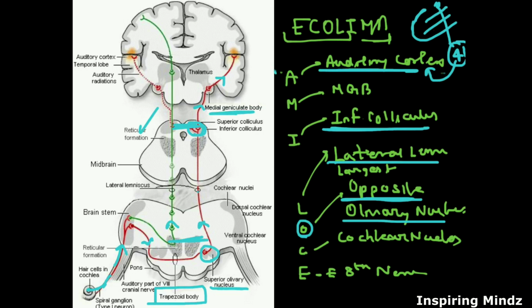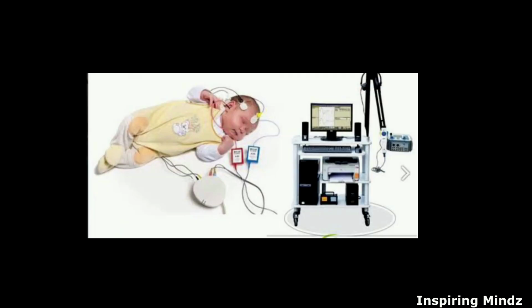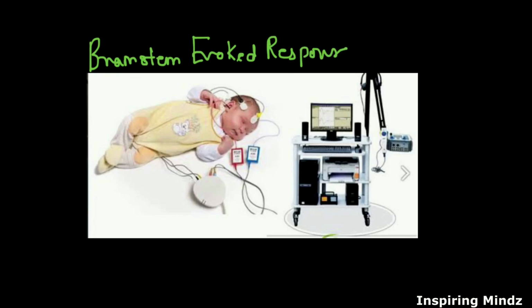Now, one of the very important concepts regarding auditory pathway is BERA. So what is BERA? First, write the full form. Brainstem Evoked Response Audiometry. So this is your BERA.